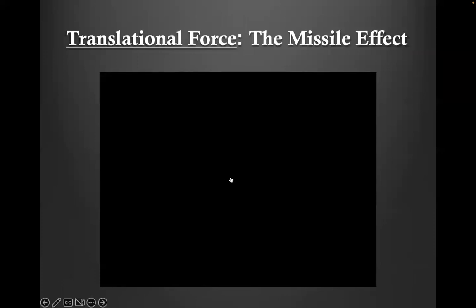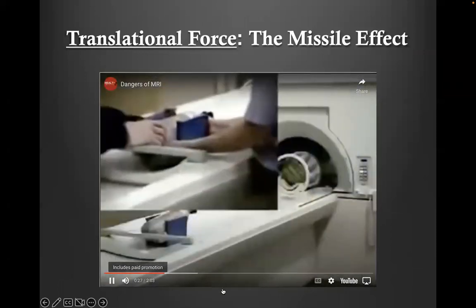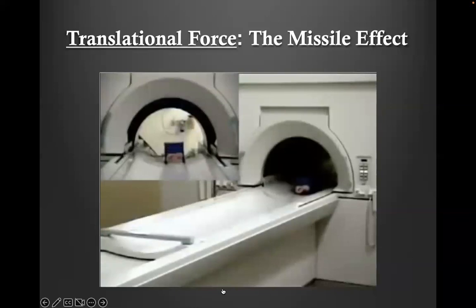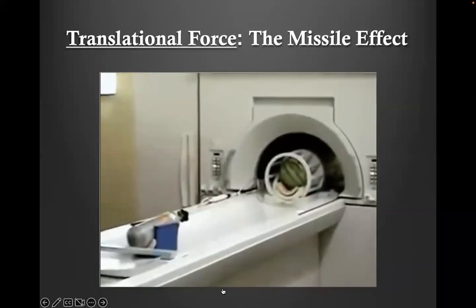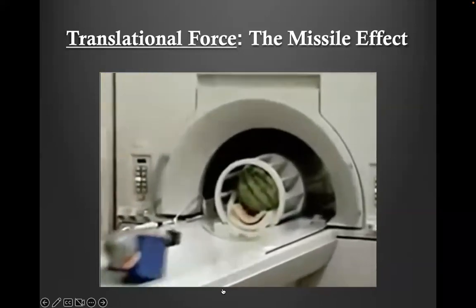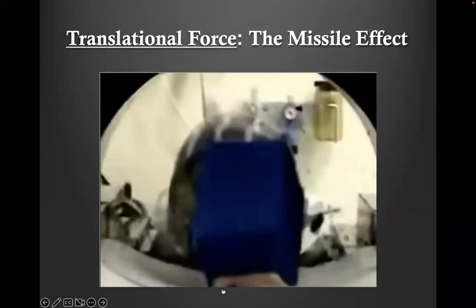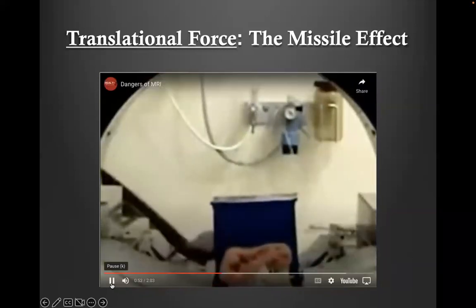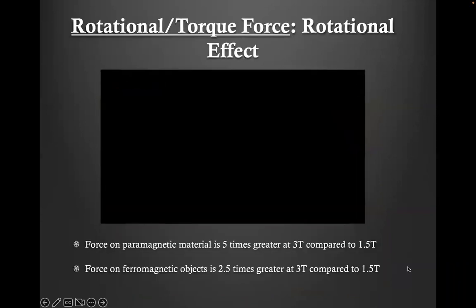And I just want to let you know how strong this can be. This is a very small oxygen tank. It can crash. So you can imagine what could happen if this is a human head, right? Let me move to the next slide.